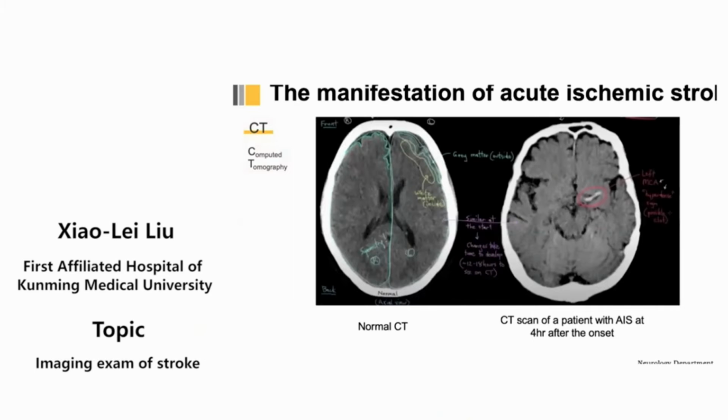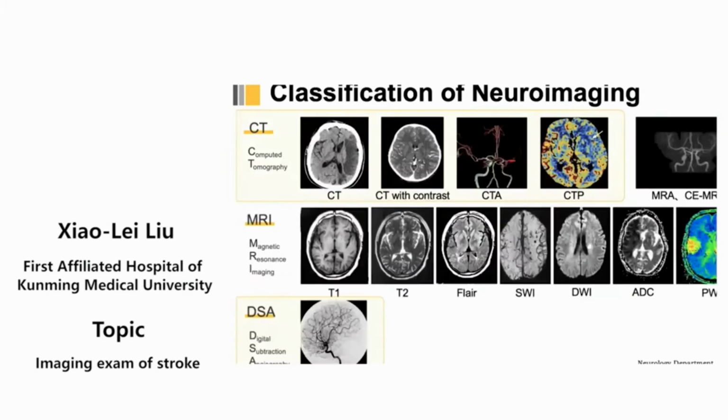And DSA is used extensively in interventional radiology for visualizing blood vessels.